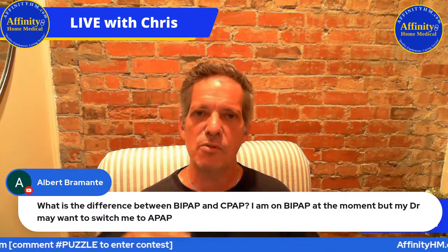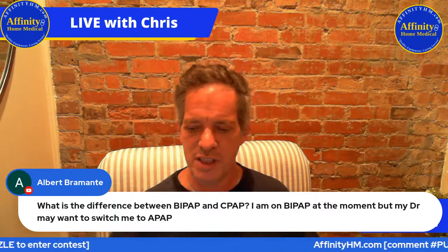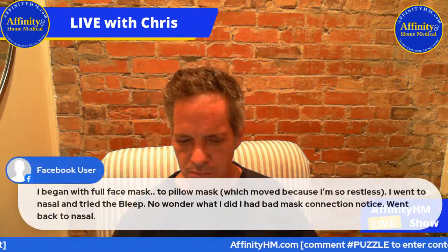But it's one pressure breathing in, a lower pressure breathing out. Way more comfortable. All right, we have another question.